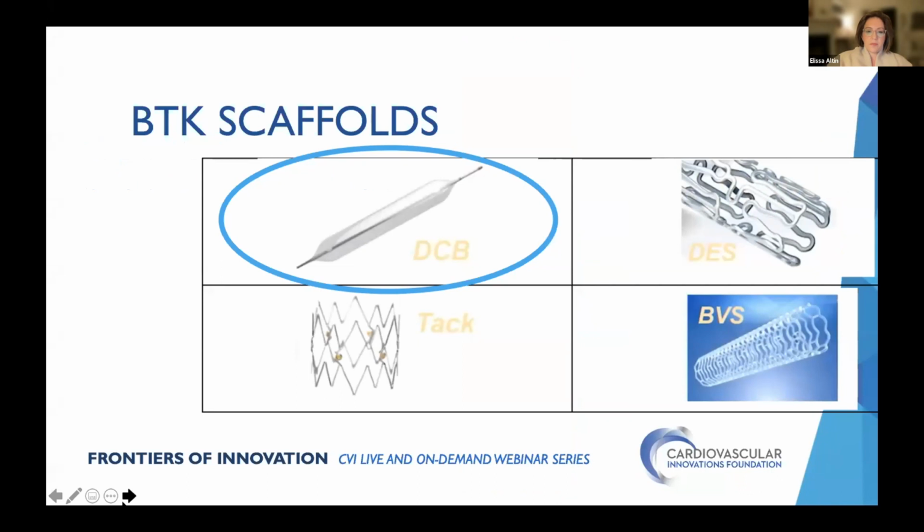So, you know, his wound healed within a few weeks, and he's been doing really well. So the question is, for below the knee, what are some options that we have? Balloon angioplasty, we know, is not great, but I think at this point, that and some calcium modification are what we have.